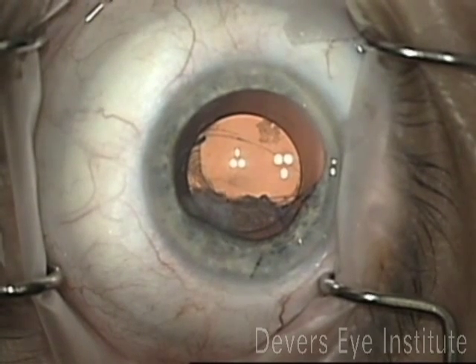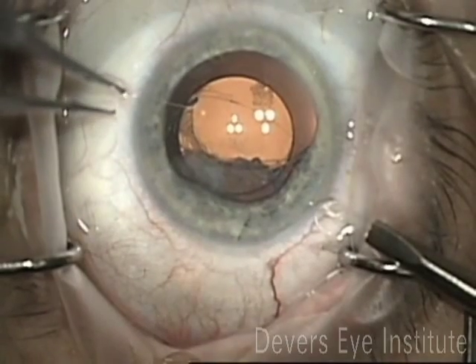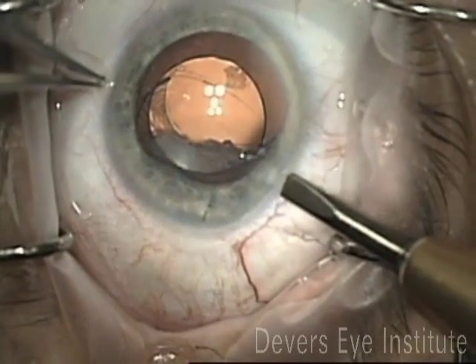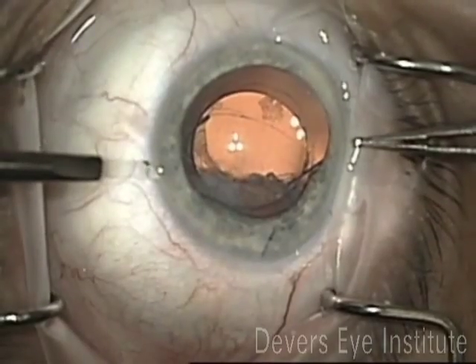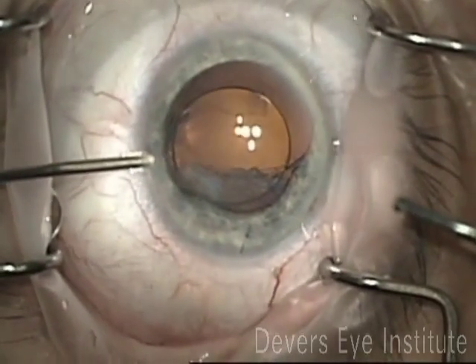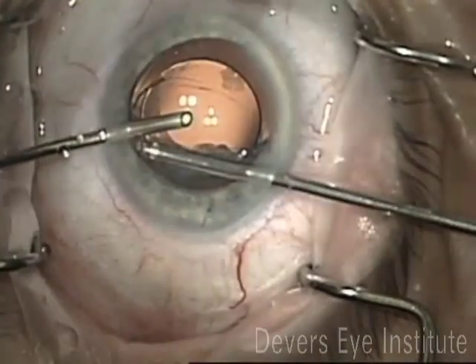Hi, this is Mike Stryko with the Devers Eye Institute in Portland, Oregon. This is a case I was recently sent with a dislocated intraocular lens that was partially in the bag. As you can see, there's some vitreous prolapse, some retained cortical material as well, and a slightly poorly centered intraocular lens.